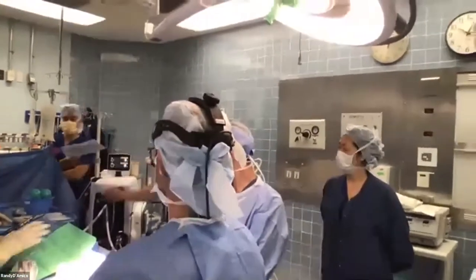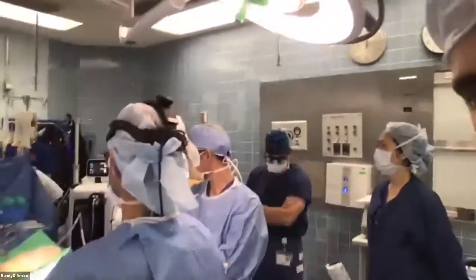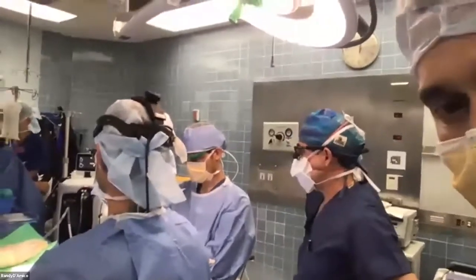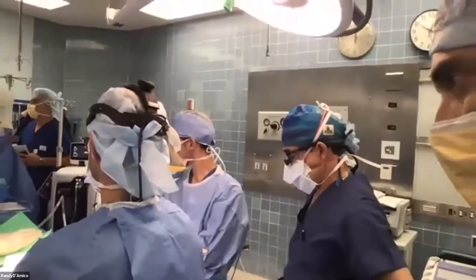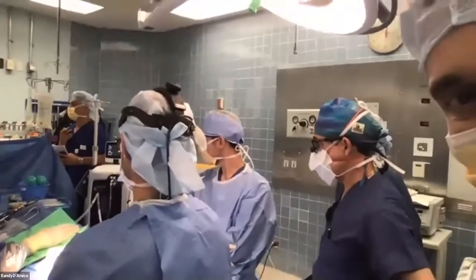Dr. Lang, procedure confirmed via consent. Patient is under general anesthesia with infiltrate. He has adequate venous access and invasive pressure monitoring. He received his antibiotics and Keppra as well as mannitol and dexamethasone. Pressure is 140, heart rate in the 70s. As for the blood, it's in the room. He's going to the ICU afterwards.